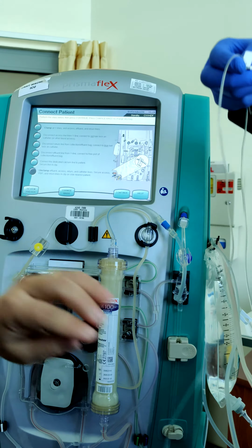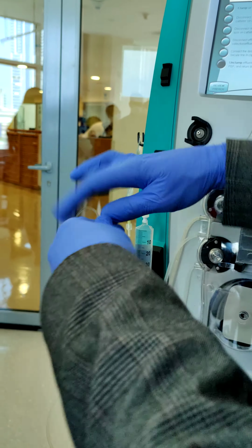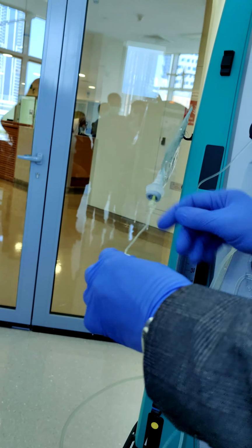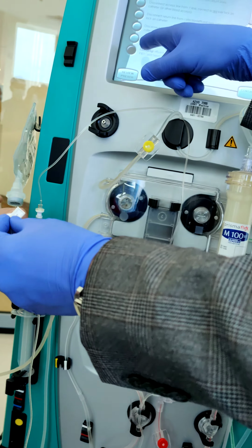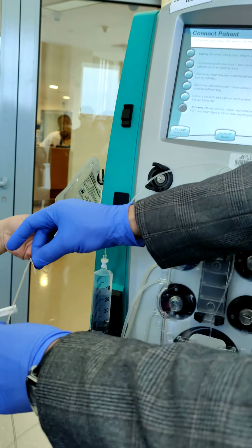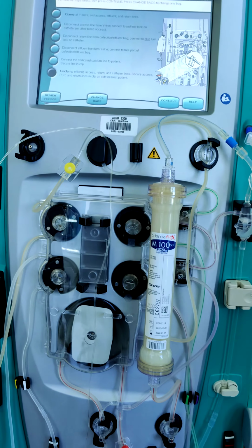Okay. Thank you. This is the patient side. Be careful with the needle. You can keep the clamp here near the patient, and you can just clamp it. And once you see unclamp, just unclamp this line also for the calcium. That will be the last clamp. And continue.